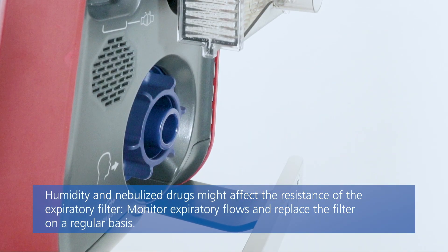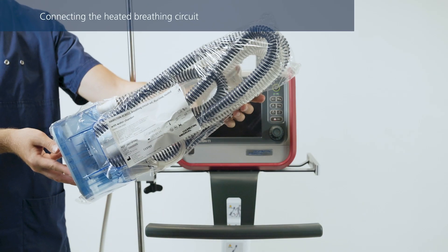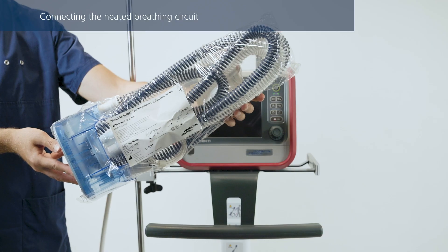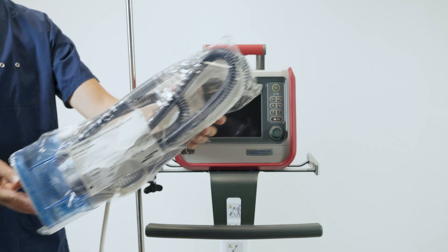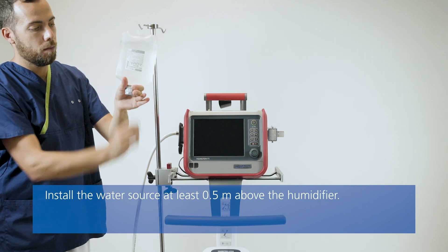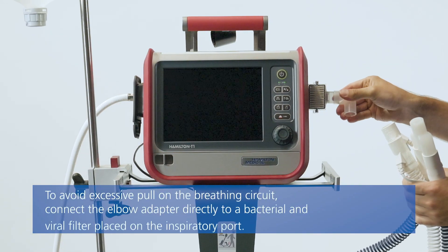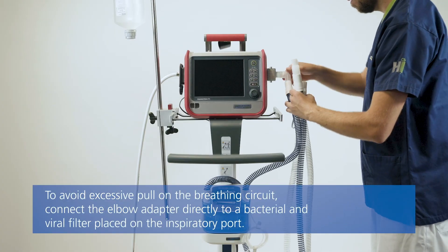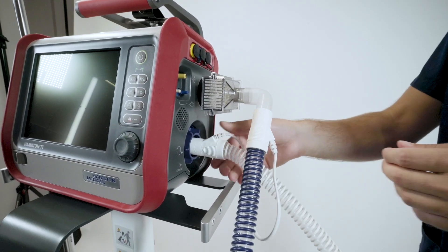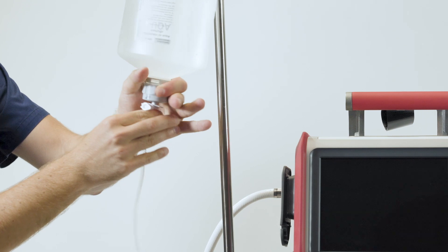If you use an expiratory filter, place it on the patient side of the expiratory valve. The following information applies if you are using the Hamilton BC8022 breathing circuit or any other double-limb breathing circuit for an active humidifier. Install a water bag or bottle above the humidifier. First, insert the humidifier chamber. Connect an elbow adapter. Connect the shorter blue tube to the inspiratory port on the ventilator, and connect the expiratory tube to the expiratory valve. Then insert the water feed line into the water bag or bottle.